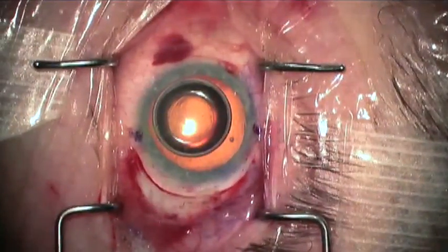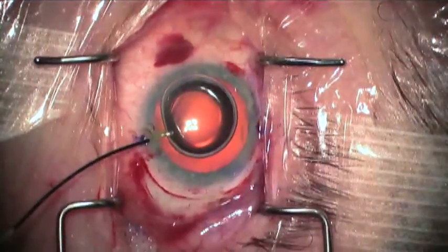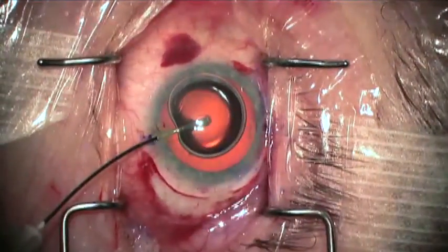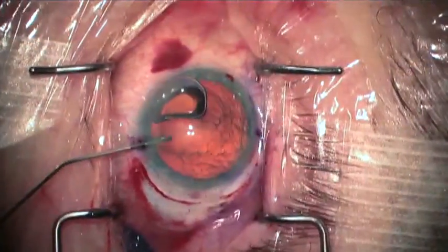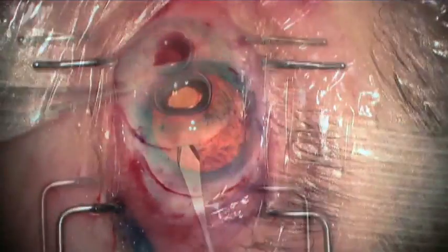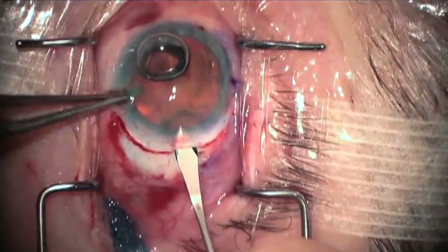Following multiple paracenteses under an air bubble, Trypan Blue is used to stain the lens capsule. This will be helpful not only in the capsulorexis, but also in seeing the loops implant under the capsule.